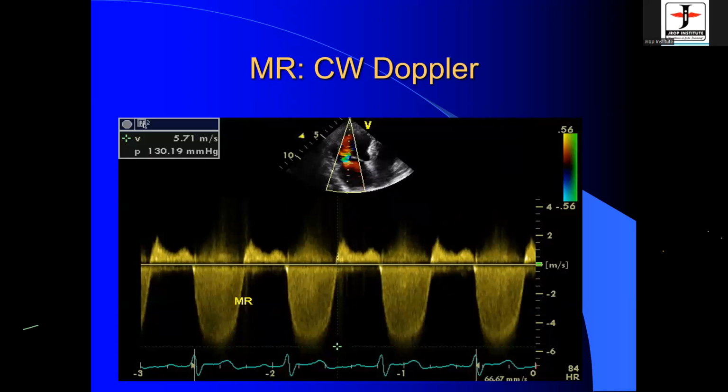And the advantage with color is that we can put it parallel to the flow. The word turbulence is for color flow. The word aliasing is for Doppler flow. Remember these two words; they are two different words. Okay, sir. Thank you, sir. Anybody else?